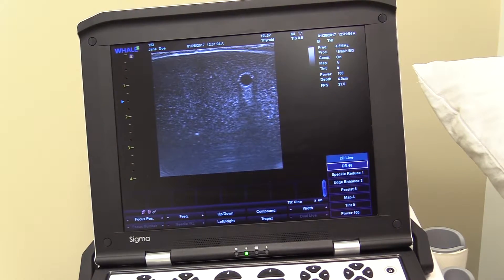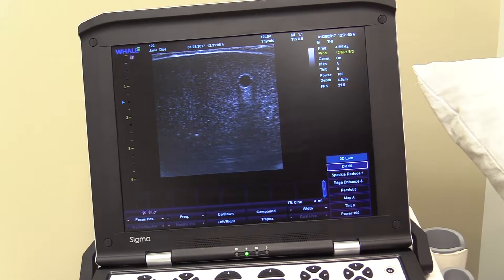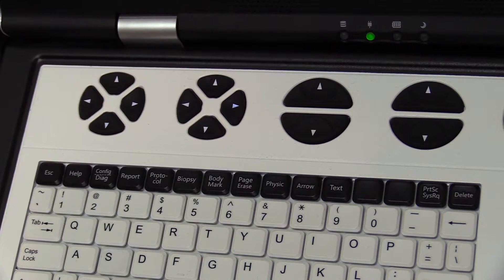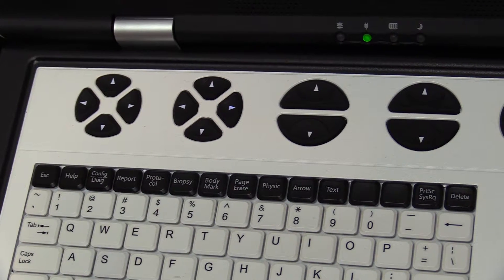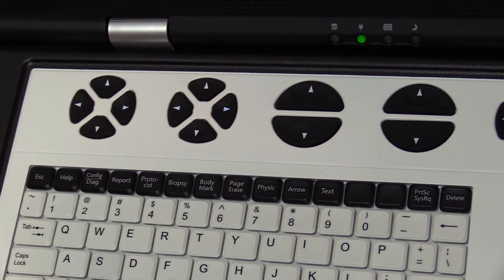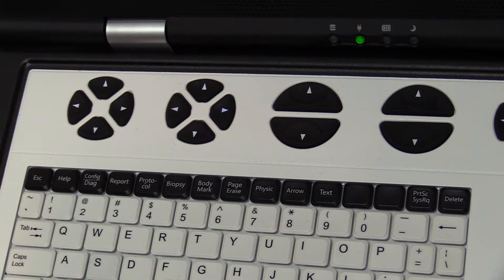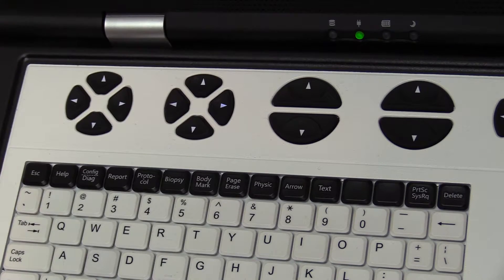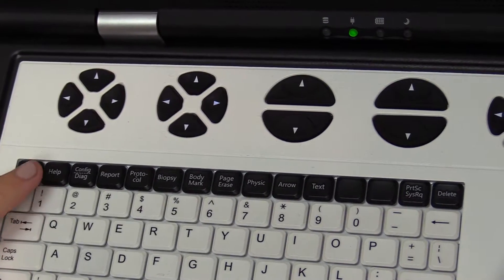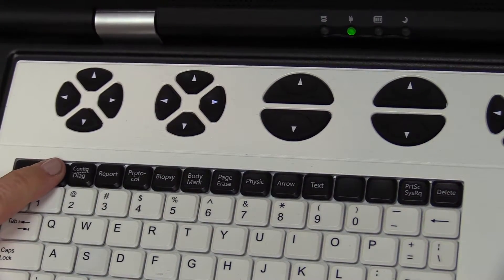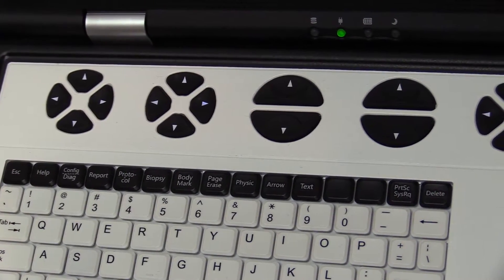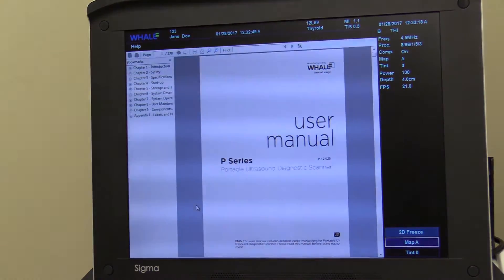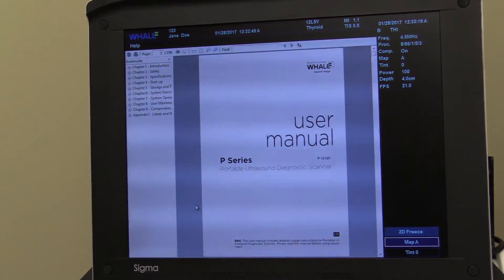Now you are ready to begin the exam. There are several important features and function keys which may be used to optimize scanning. Remember, you may always refer to the Help key for easy access to the user manual.